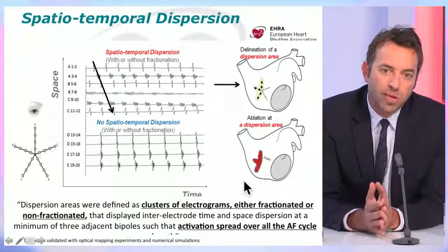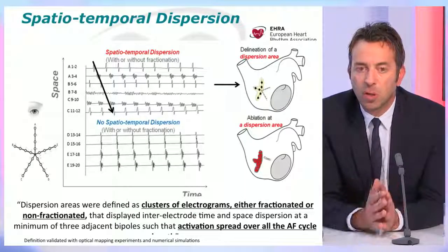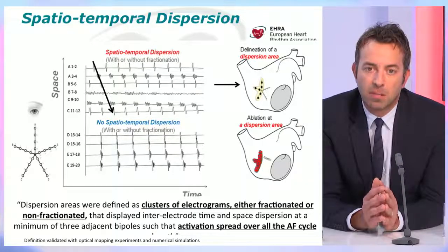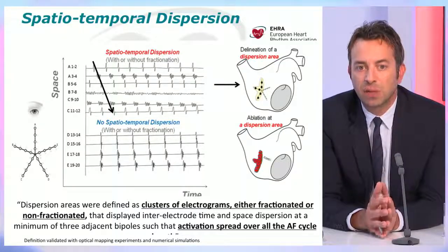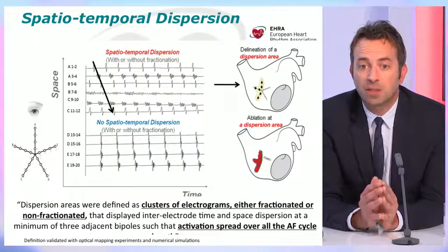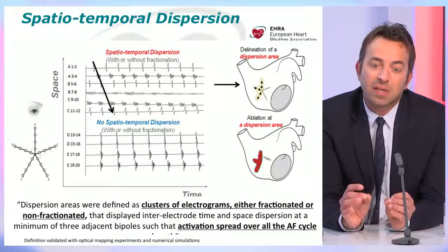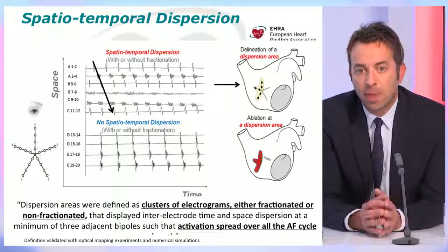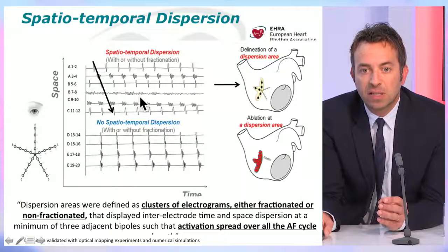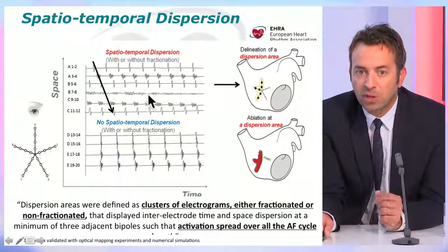For a long time, we used to perform classical CAFE mapping and ablation with a quadripolar ablation catheter. But since we started using multi-electrode catheters like the PentaRay, we realized that we had missed something very important: the analysis of the regional activation. Because, as you can see on this slide, at the location of an AFib driver, you don't observe only continuous CAFE, but also other types of electrograms.